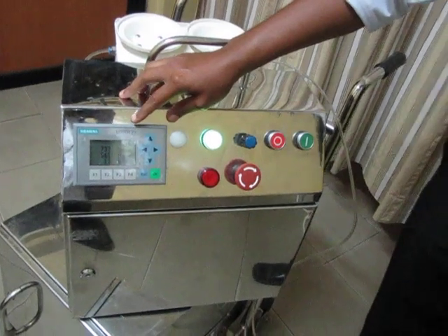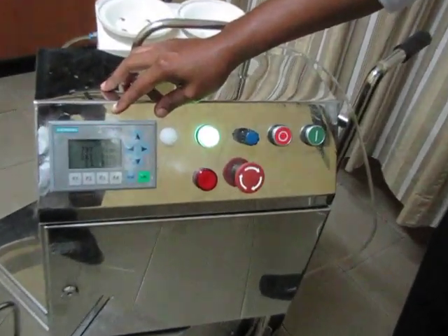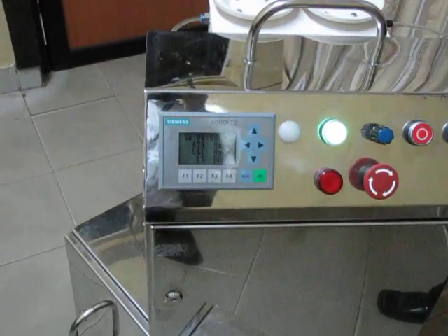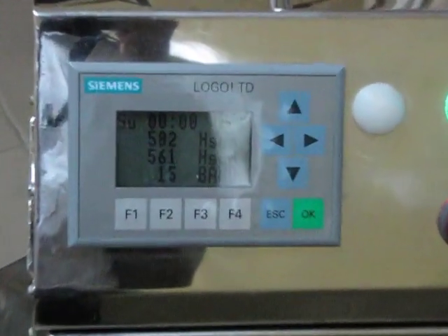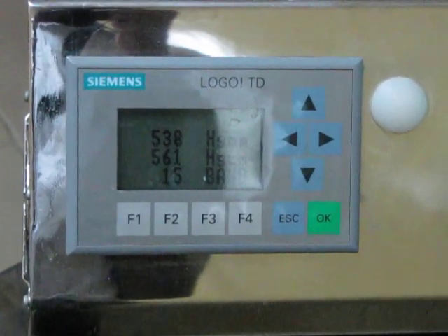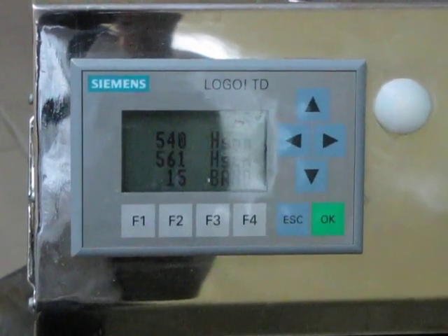So you can see the pressure is going down, and it stays around that level.